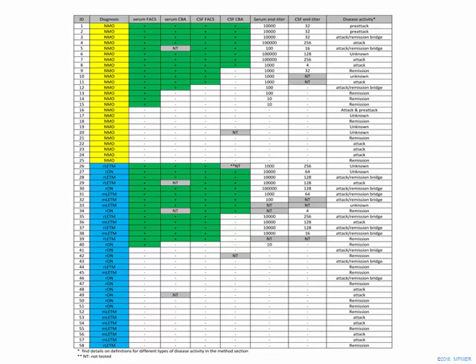This is a busy slide, but really just look at the colors. And what you can see is that if you take NMO, these are patients that fulfill NMO criteria in yellow, you can see when we looked at paired serum and CSF samples, in other words, where the serum and the CSF have been drawn within a certain short time frame of each other, you can see that the serum FACS is the most sensitive, followed by the serum cell-based assay.